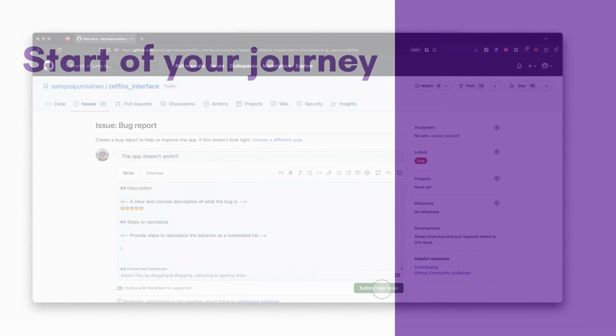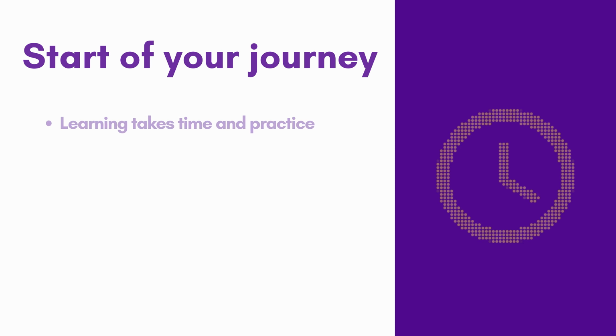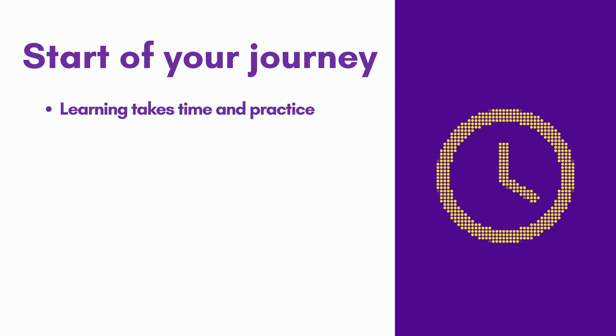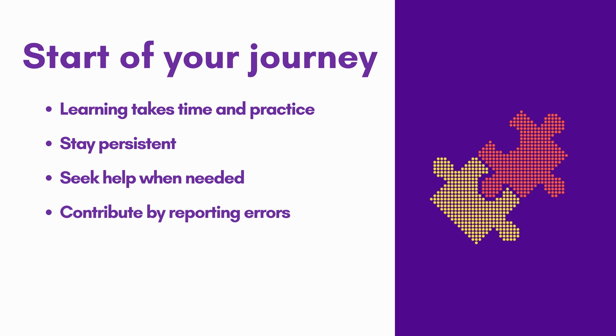This tutorial is just the beginning of your journey in optimizing TES electrode placements. Remember that learning and mastering any new software takes time and practice, so stay persistent, seek help when needed, and contribute to the community by reporting errors and sharing your experiences.